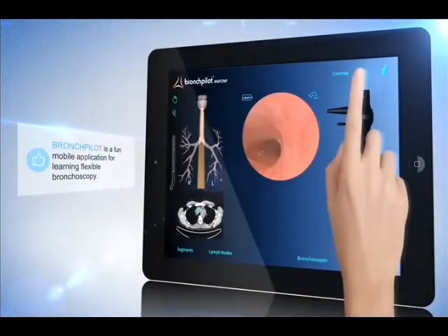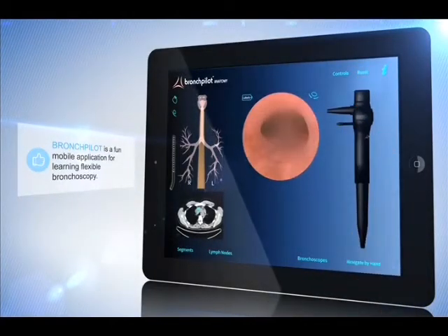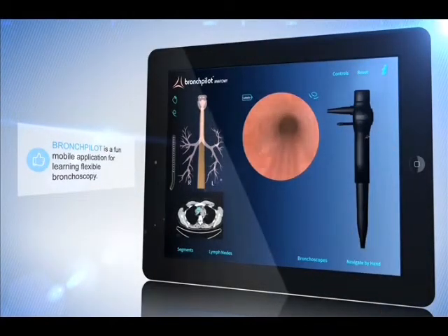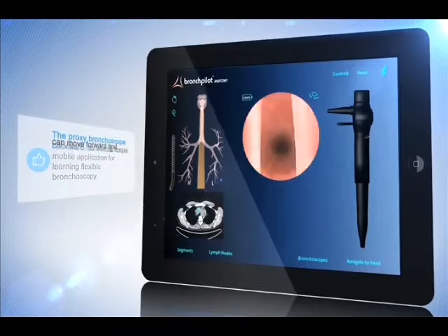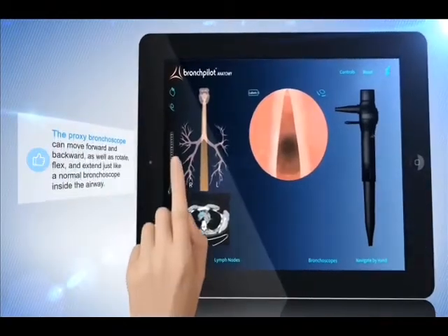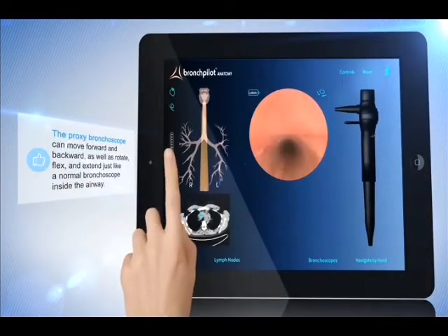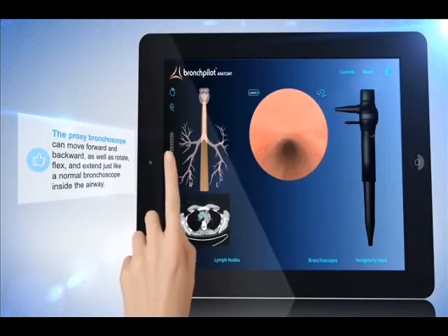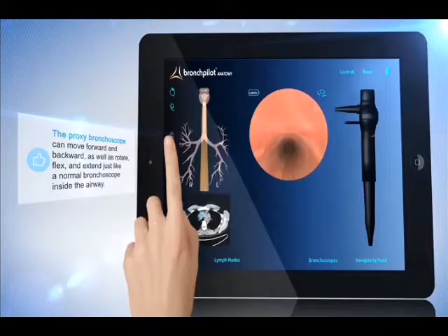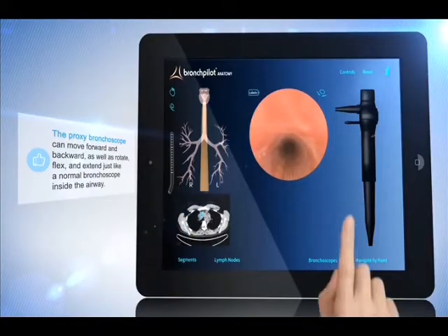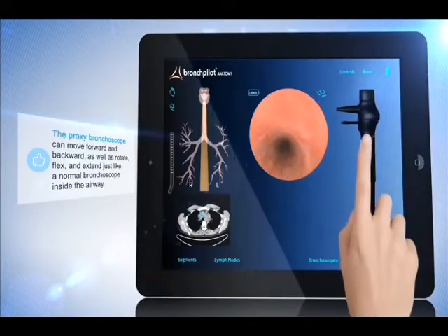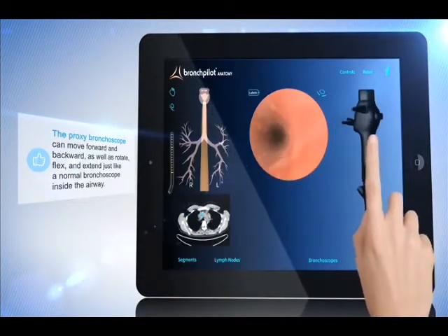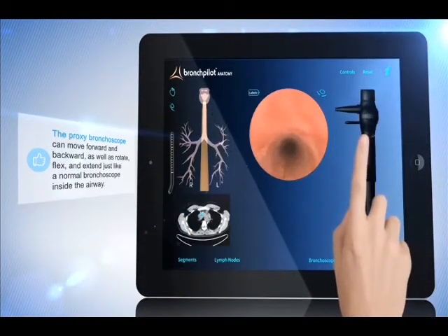BronchPilot is a fun mobile application for learning flexible bronchoscopy. The proxy bronchoscope can move forward and backward as well as rotate, flex and extend, just like a normal bronchoscope inside the airway.